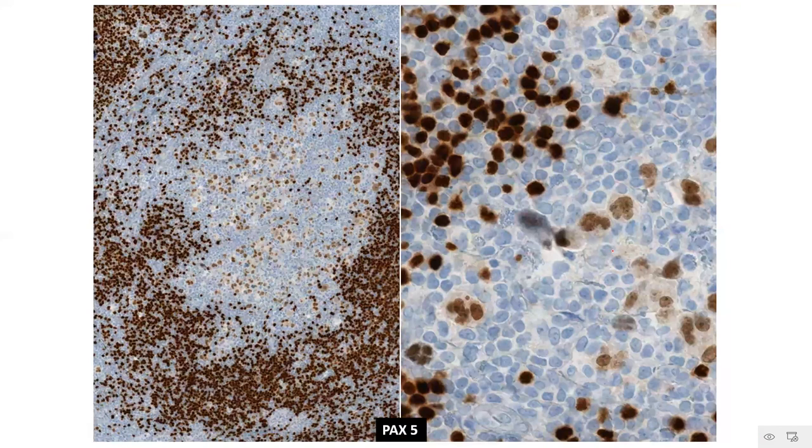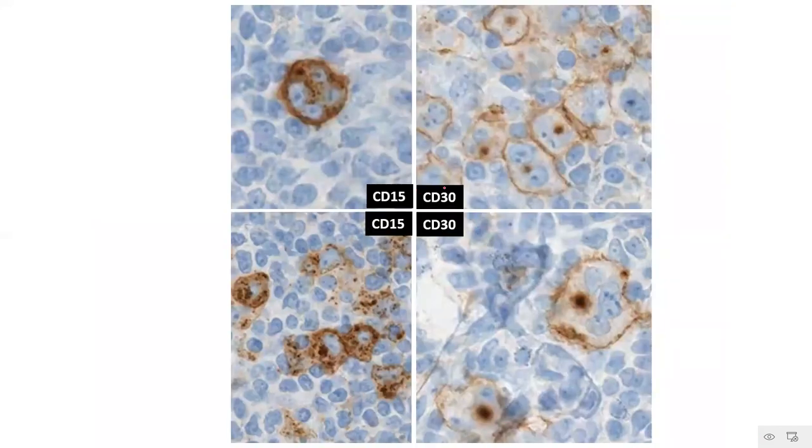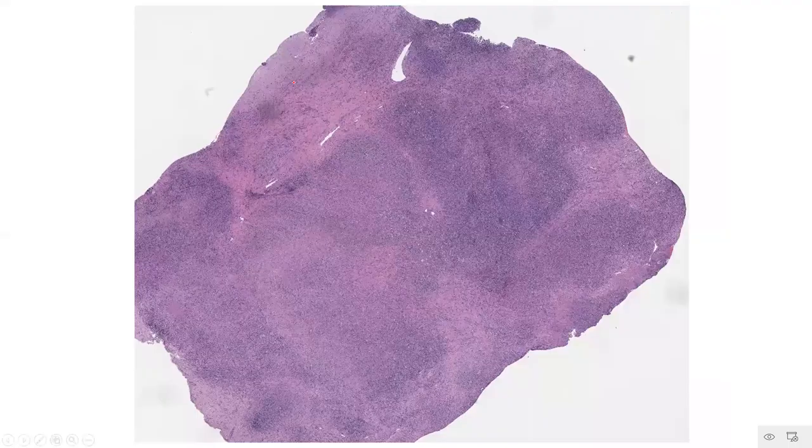PAX5 again highlights the weak, faint, moderate positivity of the atypical large cell population of the HRS cells when you compare it to the strong background positivity of the small B cells in the background. CD3 again is negative in these cells, but they show the presence of a substantial proportion of intermixed normal T lymphoid cells. CD15 and CD30 show you the characteristic pattern of expression in the cell membrane as well as in the paranuclear Golgi zone in these atypical Hodgkin-Reed-Sternberg cells.